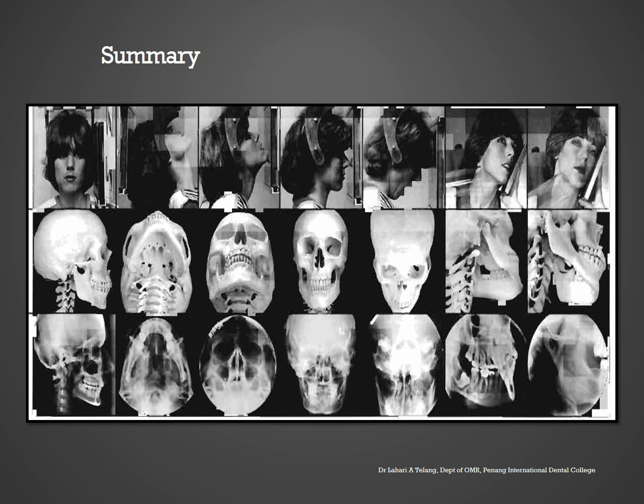Now, most of these X-rays are actually less utilized in a routine dental setting. The reason being that the panoramic and CBCT images have actually made these particular images obsolete. But nevertheless, it's important that you understand and remember that these views are also to be used in low resource settings and in settings where a dental radiology setup is unavailable and you only have the medical radiology facility. Then you would want to utilize these views to help you image the area that specifically is required to be seen.